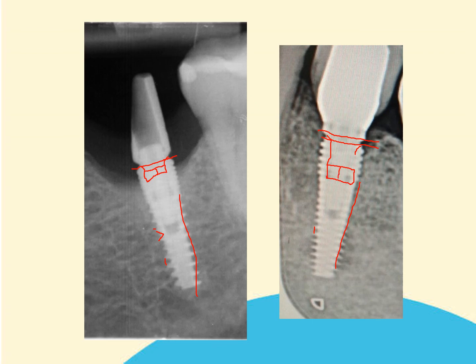Again, not easy to spot, but if you look at where the abutment screw starts to appear clearly, it's in this area here, whereas the abutment screw is tending to appear just perhaps a little higher up. But again, it's not easy to differentiate the two, apart from perhaps looking at the implant body itself and looking at the thread pitch, which tends to be wider, and looking very, very carefully at this implant abutment interface, which, as I say again, is flush. So the abutment actually fits flushly onto the implant platform. On this situation here, the abutment is actually separated and sits above the implant platform, and you can almost make out in that area a very, very small space.